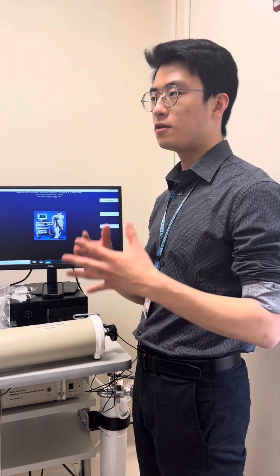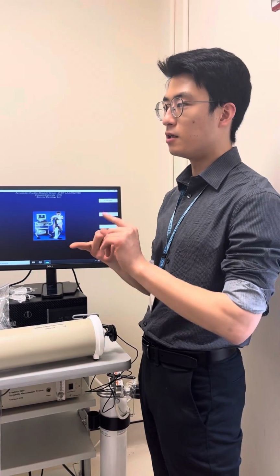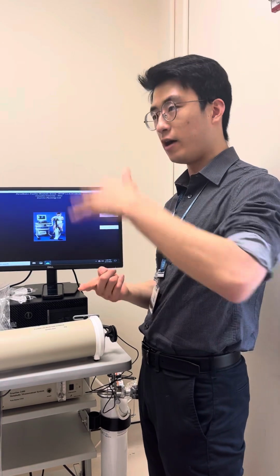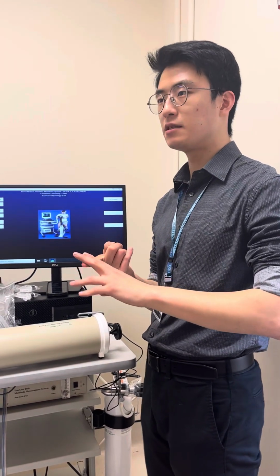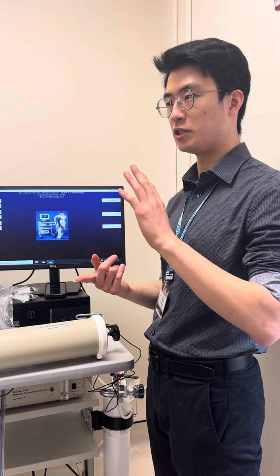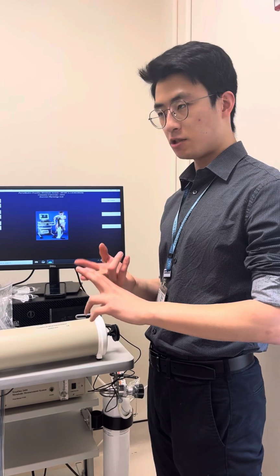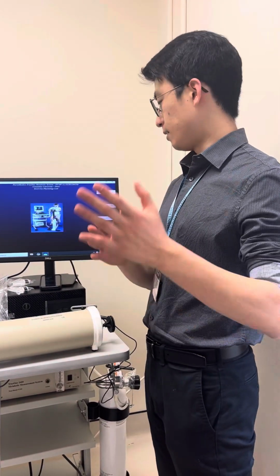It's important to note that the respiratory exchange ratio, number one, varies with stress. So if a patient is hyperventilating because they're nervous, it'll be artificially elevated. And number two, it's supposed to rise with exercise after a certain point.